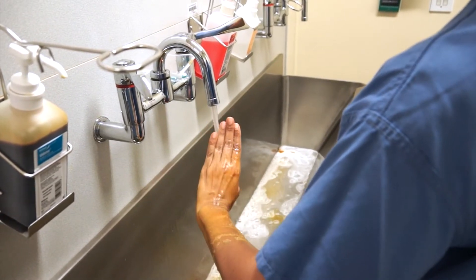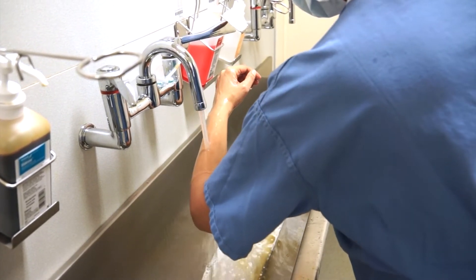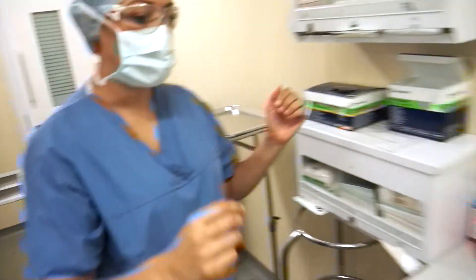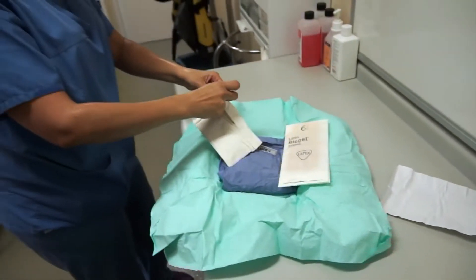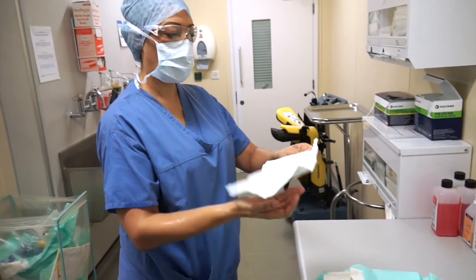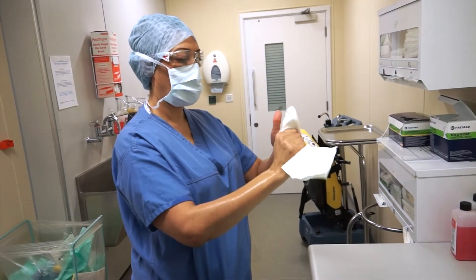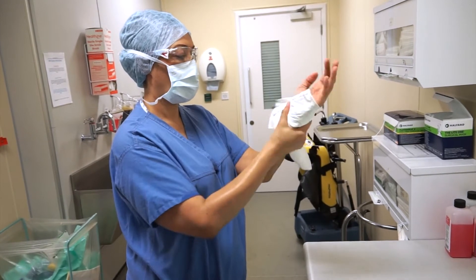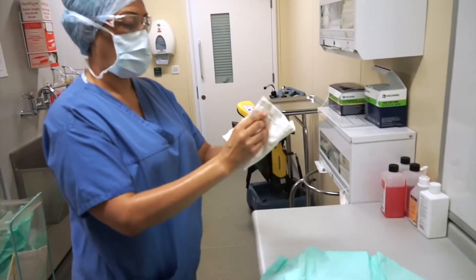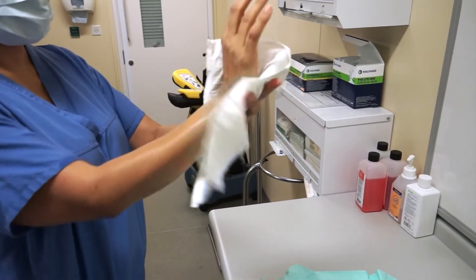So I'll rinse off. Any particular scrub solution we should use? You're pushing things off with your elbow — it's important to remember — and keeping your hands up as you walk across. Now I'll separate the two hand wipes. What you need to do now is keep the hand wipe folded in half, ensure that you're drying between your fingers, make sure you dry those web spaces, and then pat down your arm to your elbow and discard — not touching the bin, not touching anything else. It's important to get it dry because it's very difficult to get your gloves on if it's been damp.